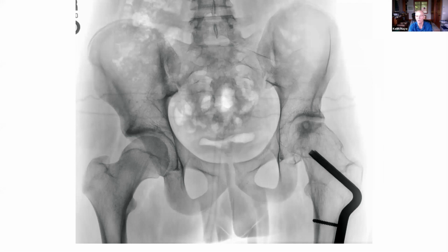And this is what it looked like when he was now, I think, 21. And I had really wanted to come back at a later date and do a lateral trochanteric transfer, but he was having none of that. You can see that he already has a lot of remodeling around the proximal femur, and he didn't want to even have the plate taken out.